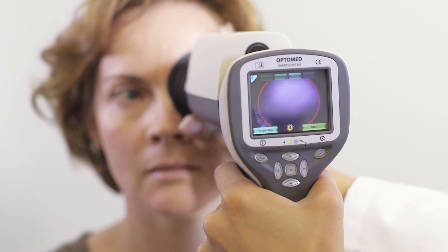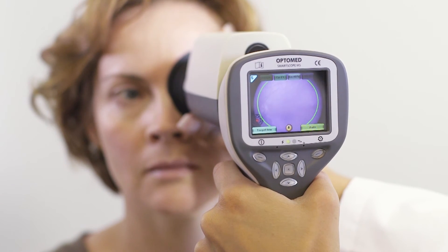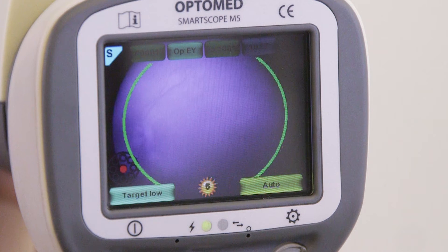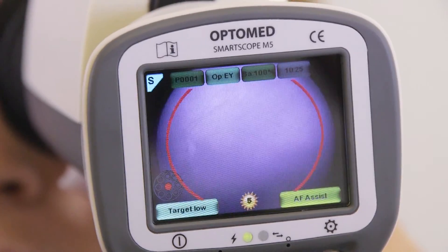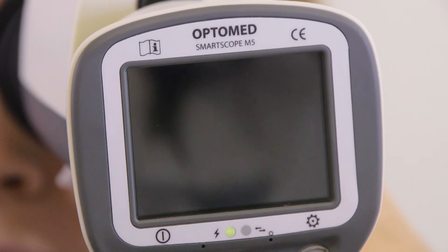The aim help feature indicates to the user when the aim on the retina is good for taking an image. If the circle is red, the aim is not good and the retina does not fully cover the image area. If the circle is green, the aim is good and the image can be taken. Capture the image by pressing the shutter button when the aim help circle is green. If assist mode is used, the image is taken automatically as the circle turns green.